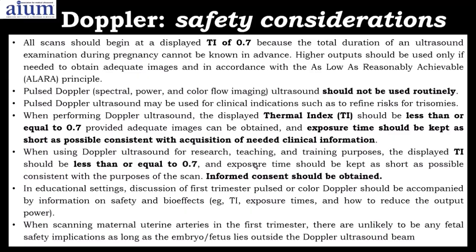Also, adhere to the ALARA principle, which stands for as low as reasonably achievable. It is another key component of utilizing Doppler in the first trimester.